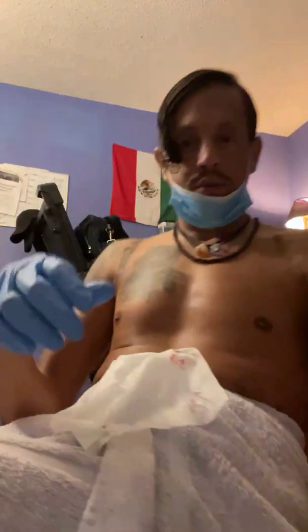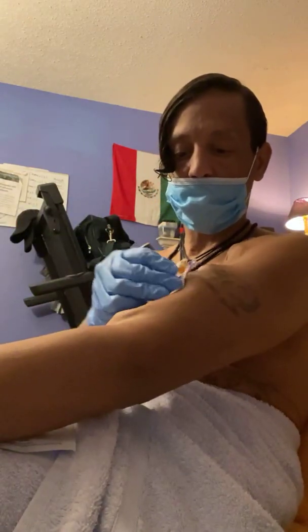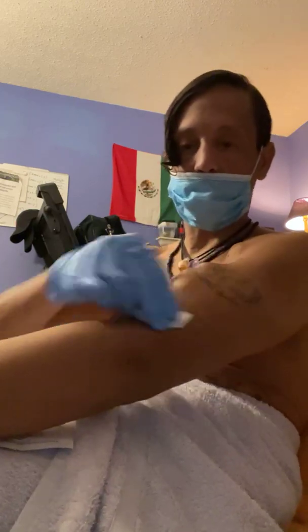Good. Now all we do is take the scab off, pull. Let me show you here in a minute. Yes. So you can see the scab is now removed. And we got a little bit of blood flowing there, so now all I'm gonna do is just grab some alcohol pads and clean it up a little bit. It might sting a little bit, but it's okay.